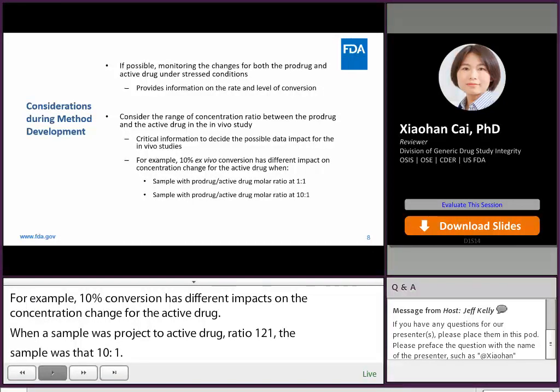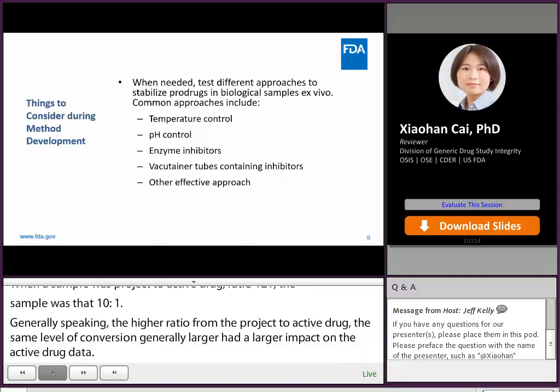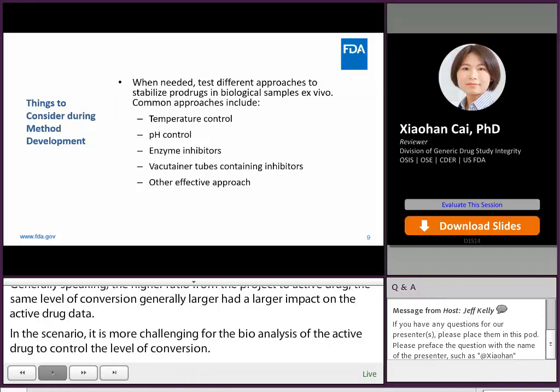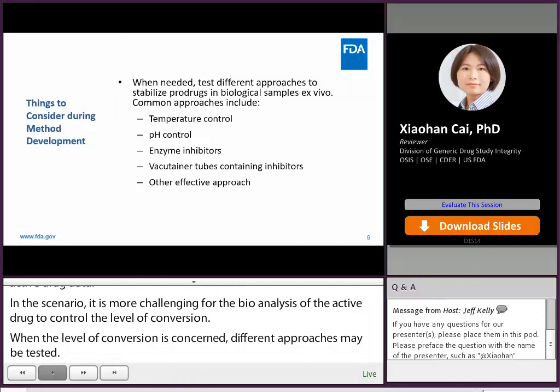In this scenario, it is more challenging for the bioanalysis of the active drug to control the level of conversion. When the level of conversion brings concern in the bioanalytical data, different stabilization approaches may be tested. Commonly reported methods include temperature control, pH control, adding enzyme inhibitors, and vacutainer tubes containing inhibitors. Sometimes a method may use a combination of these approaches.